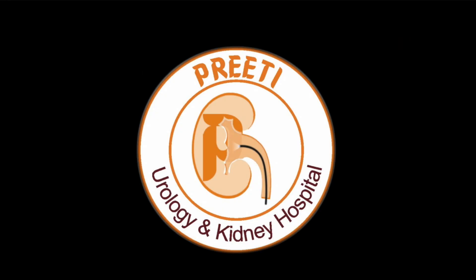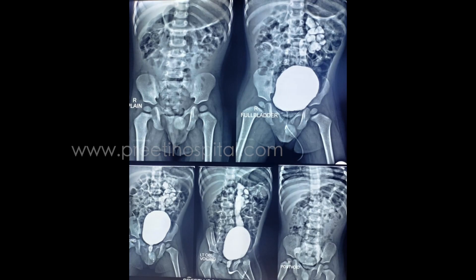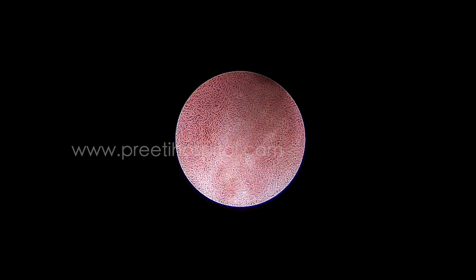Here is a case of unedited video of posterior urethral valve fulguration in a 2-year-old male baby with thulium fiber laser. Most of the time we do not get the opportunity to see how fulguration is done with laser.